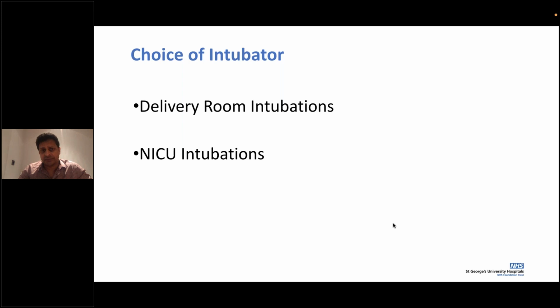Most NICU admission intubations are quite often babies who've had some kind of a tube in the past, or it has been an accidental extubation or a planned extubation or a planned elective intubation. So in that case, it would be the right place for you to offer yourself, and quite often what happens is the middle grade or the consultant will say, would you like to have a first go?